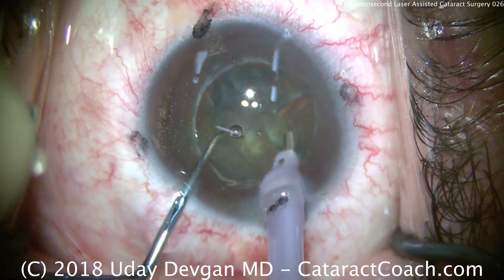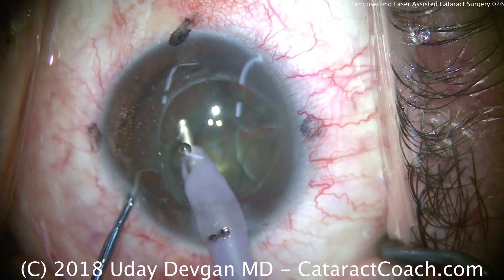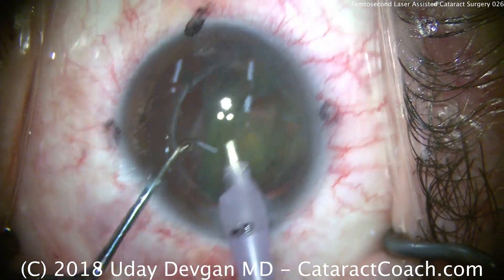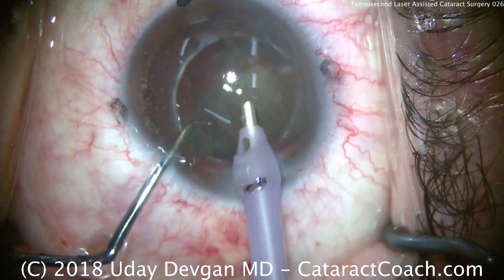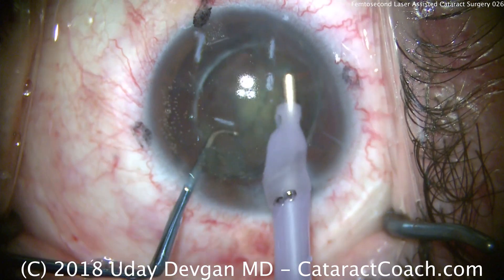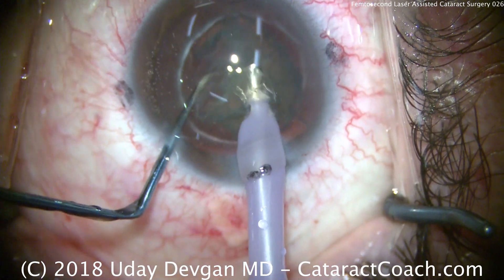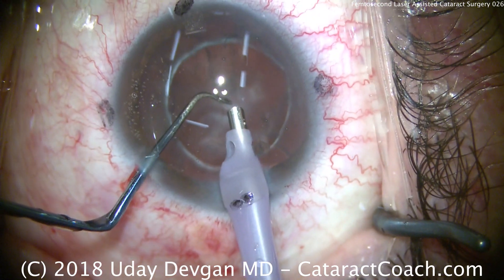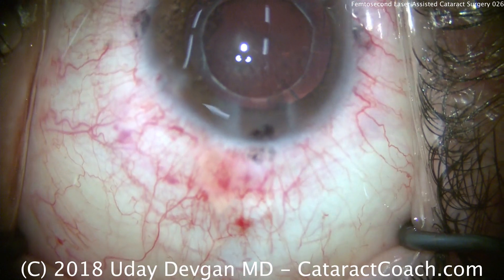Now we'll aspirate into a quadrant to bring it up and remove it. In a soft cataract like this, we're just looking for vacuum to hold the piece and bring it anteriorly into the anterior chamber, taking the four pieces down one by one. The chopper is not used to chop the nucleus per se, but rather to feed pieces into the phaco probe. The chopper then goes into a protective position to prevent the posterior capsule from coming forward, and just like that the nucleus is removed.